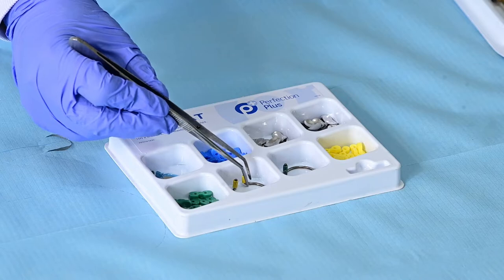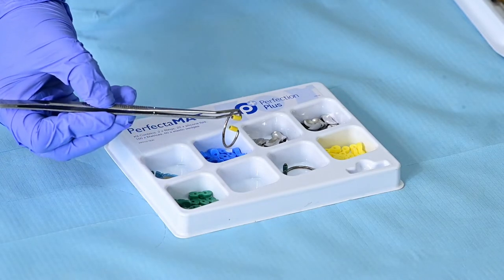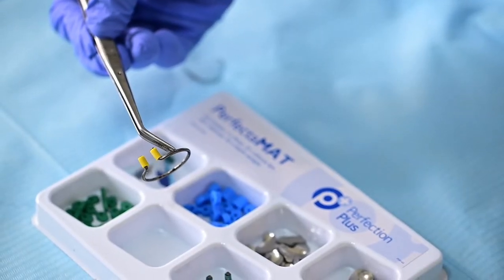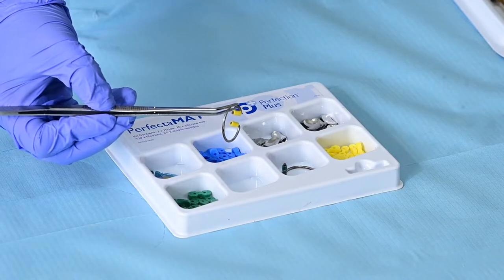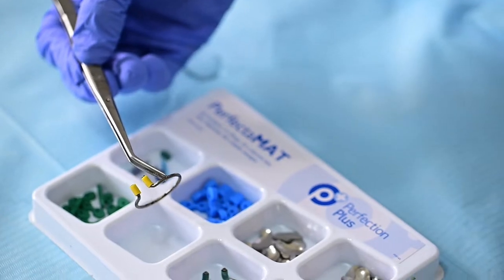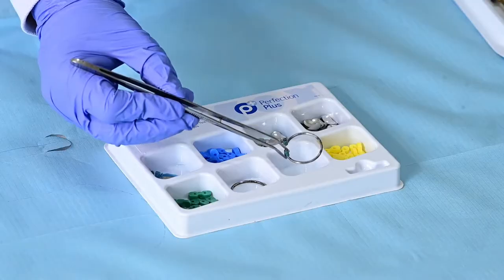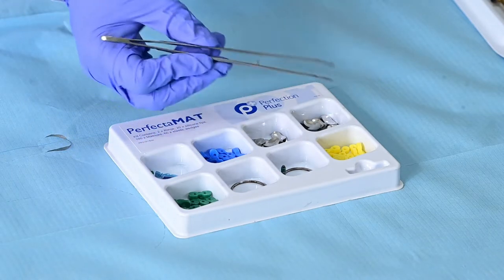And then we have the ring. The ring is supposed to adapt interdentally, buccally and lingually or palatally to secure the sectional matrix. We shall be demonstrating that. And they come in like this is good for the premolar and this is a bit wider. This is for the molar. We had already introduced this as the smallest elastic wedges.